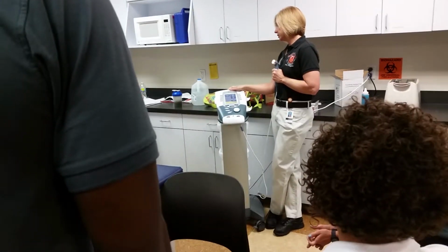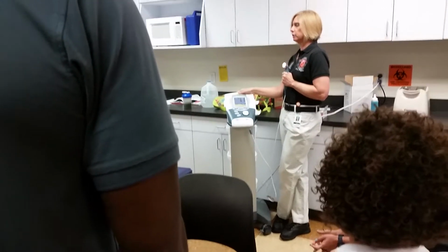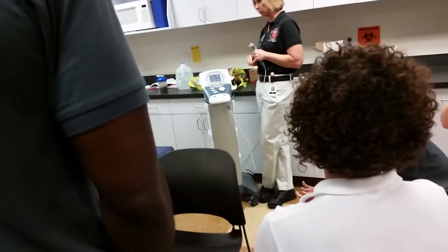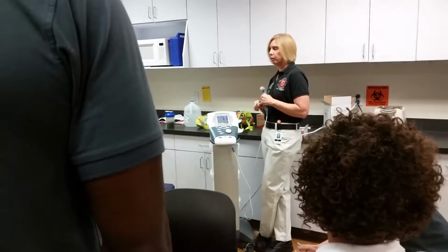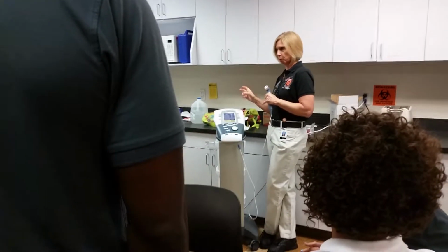Okay? And then for 1 megahertz, that's a deeper application. You're going to need to go higher in intensity. Because remember, things absorb, attenuate over the distance. So you want to make sure it's high enough to get to those deeper layers. Okay, so usually that's somewhere between 1 and 2.5 watts per centimeter squared for continuous thermal applications.